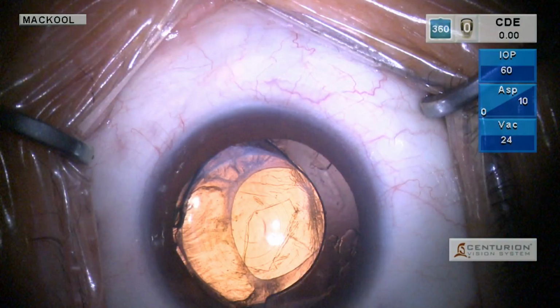This patient has undergone cataract extraction with implantation of a trifocal PanOptix intraocular lens 3 months ago and was referred with a decentered and tilted intraocular lens. As we can see here in this left eye, the superior edge of the optic is tilted anteriorly, and in fact it's captured by the anterior capsule.